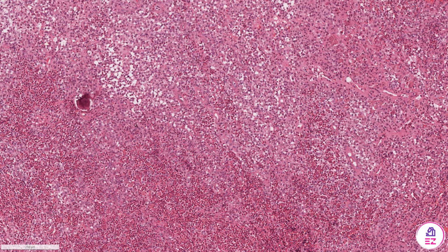Today's case is an example of Langerhans cell histiocytosis occurring in the body of the mandible in a 3-year-old child. So on the imaging, this patient had a large radiolucency associated with the apices of the molar teeth, and that tissue has been biopsied.